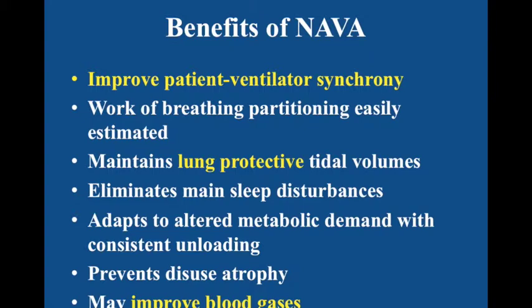So what is the benefit of NAVA? First, the most important one is to improve patient-ventilator synchrony. We can also reduce the patient's work of breathing, maintain lung protective tidal volume, eliminate sleep disturbance, and adapt to altered metabolic demand with consistent unloading, and also prevent diaphragm atrophy.